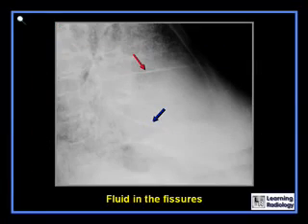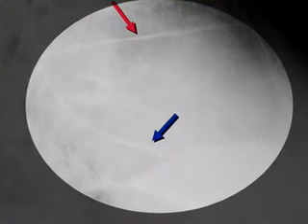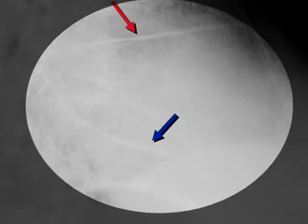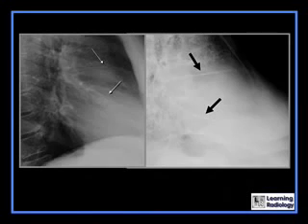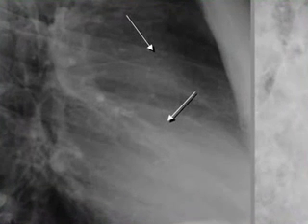This is an example of fluid in the fissures. The red arrow is pointing to fluid in the minor fissure, and the blue arrow to fluid in the major fissure — these are thicker than the point of a sharpened pencil. This is also an example of the same individual before fluid accumulates in the fissures, where they are visible but very thin, and then after the fluid accumulates, where the fissures are much thicker.